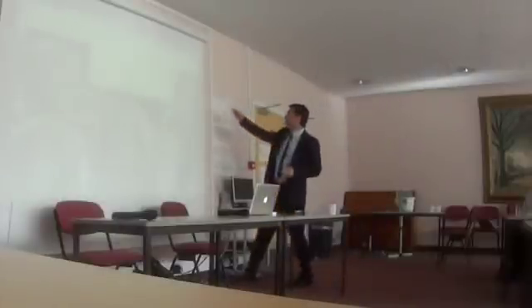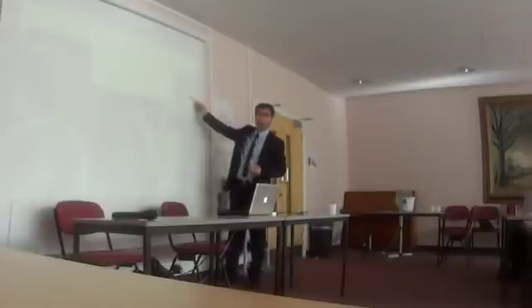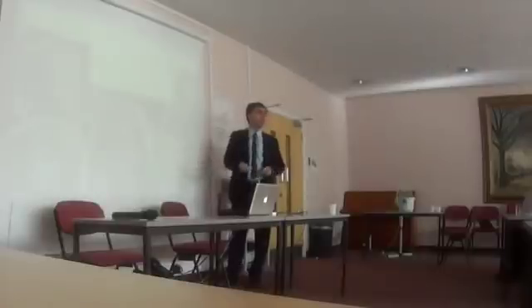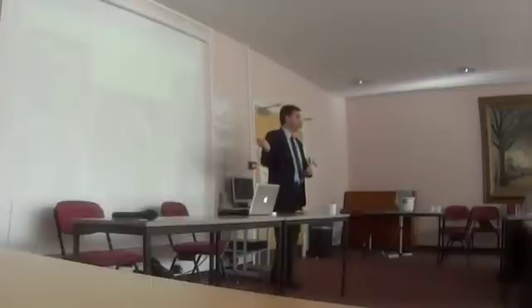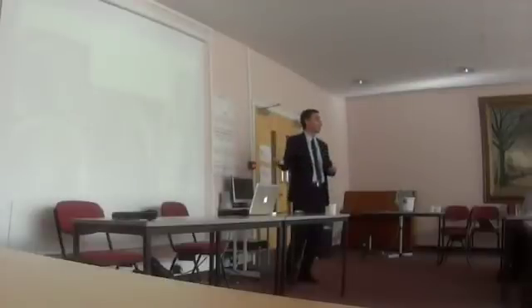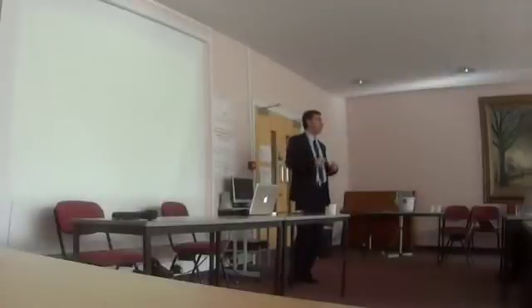There were further images, but it was rather unusual. The unusualness, when we looked at the scar, was that it was in what we call the subendocardium, within the muscle, and outside the muscle, almost everywhere. It didn't fit in with any of the patterns I told you. But I knew he had hypertrophic cardiomyopathy. It was diagnosed by my colleague several years ago, and the report has now come back, it's got HOCM. We did all the other fancy tests, all the rare conditions, to see whether he had any of those, he had none.